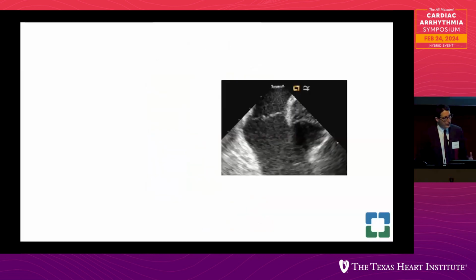So now, when we look at intracardiac echo, you really realize that there is a lot going on in that location. Here you can see an intracardiac echo, the same one that I showed you before. It just flipped the other way around, because that's the way I still look at it, because there's a University of Pennsylvania approach for echo.